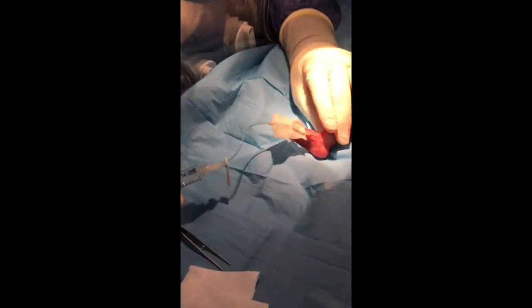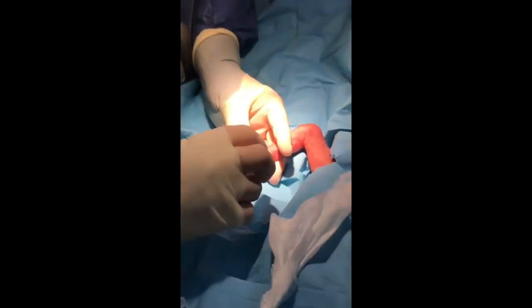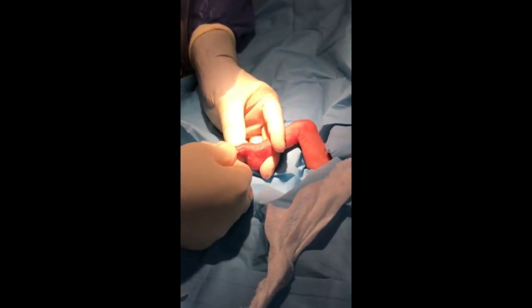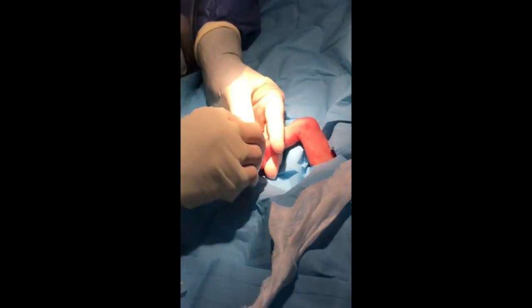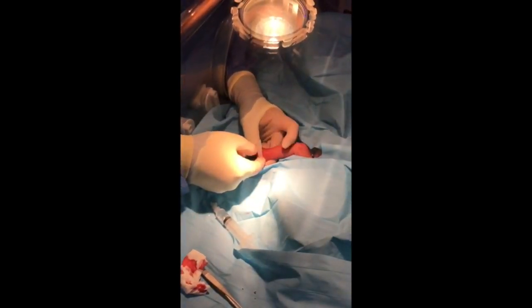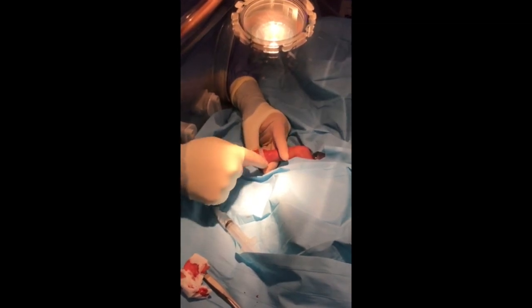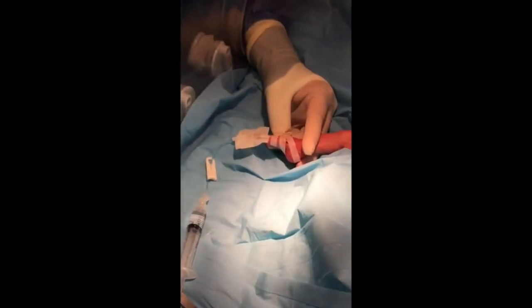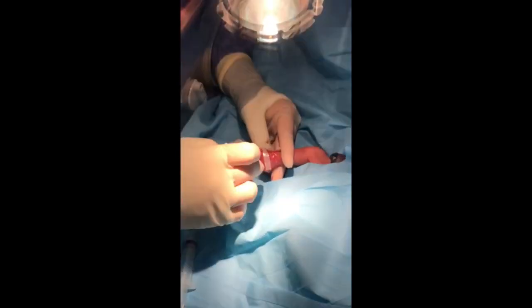All PICC lines need to be aspirated to confirm that they are in a large vein. They must also flush easily. The cannula can then be removed, ensuring that hemostasis is achieved at all times. Once hemostasis has been achieved, a steri strip can be placed at the point of insertion. This will help anchor the line and prevent it moving. You can then place a transparent sterile dressing over the area and the line, ensuring that this is not circumferential.